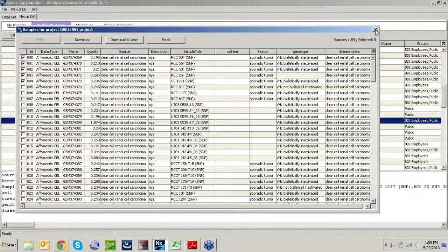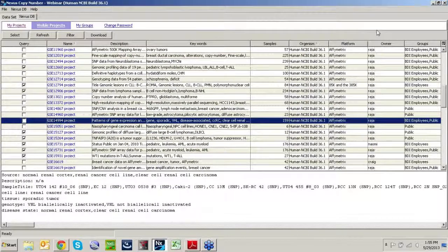If there's anything that's missing that you'd like to see, you can always send us an email and we can see about adding it in. And of course, if there's any data that you yourself have that you want to share with others, you certainly can. You are by no means required to do so, but if you want to, that is an option.